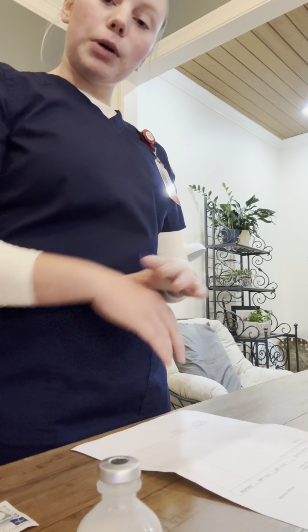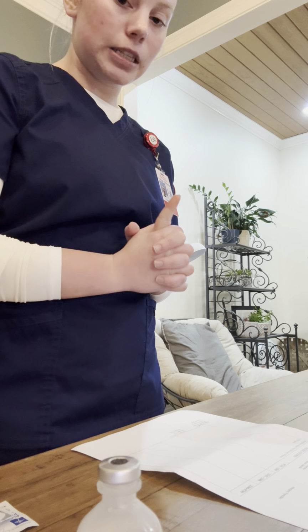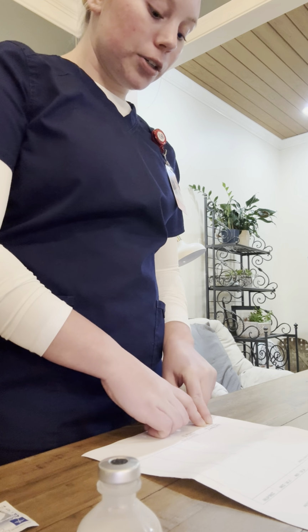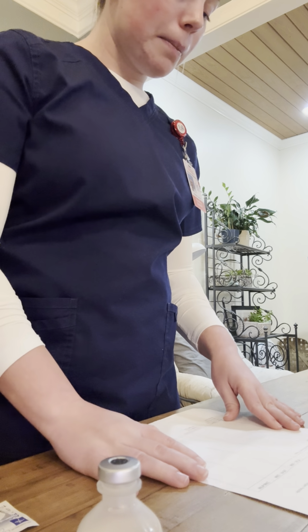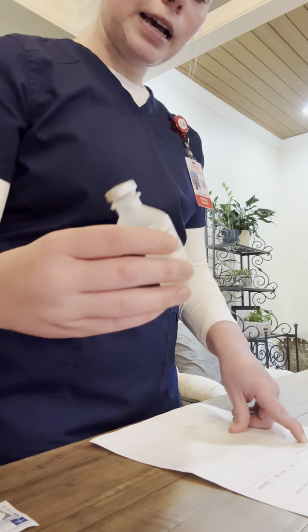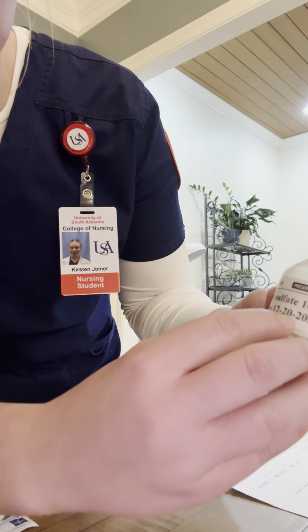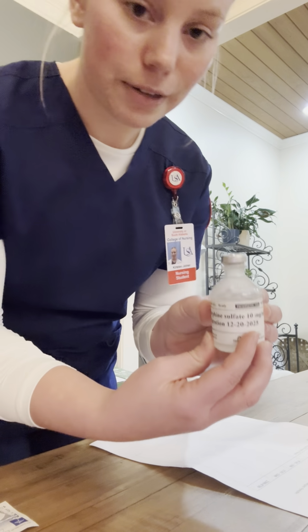So I'm going to wash my hands, and then I'm going to begin my first check for accuracy. These are the 7 rights. So my right patient is Jaguar J. Jones, medical record number 417-6352, allergy to penicillin. My drug is morphine sulfate. Here I have a vial of morphine sulfate. I'm going to check the expiration date. It expires 12/20/2025, and we're well within the date, so this is safe to use.